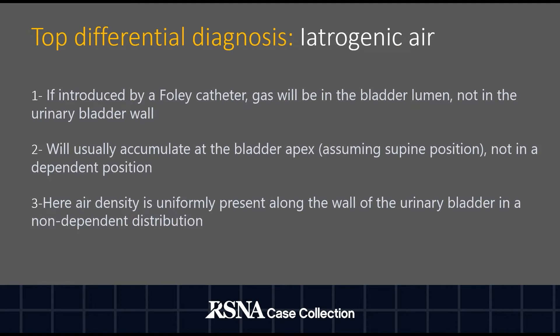Some top differential diagnoses to consider: first is iatrogenic air. If introduced by a Foley catheter, gas will be in the bladder lumen, not in the urinary bladder wall, and will usually accumulate at the bladder apex, not in a dependent position. Here, air density is uniformly present along the wall of the urinary bladder in a non-dependent distribution.